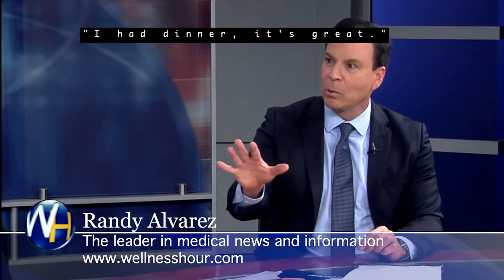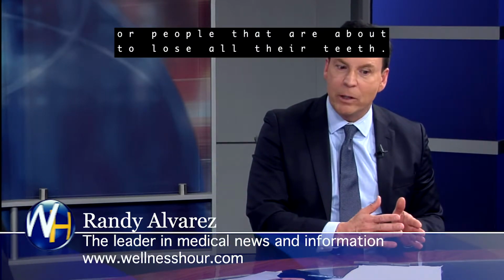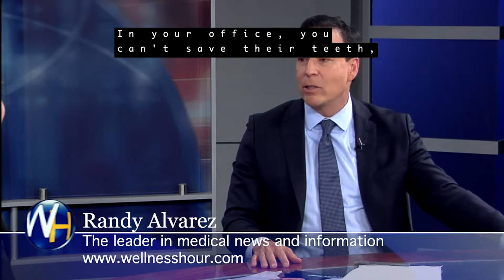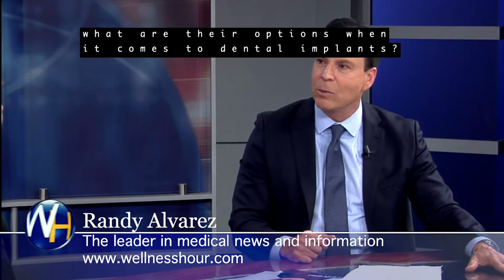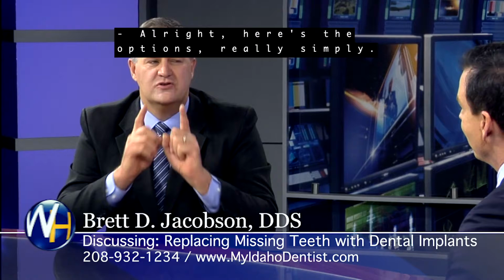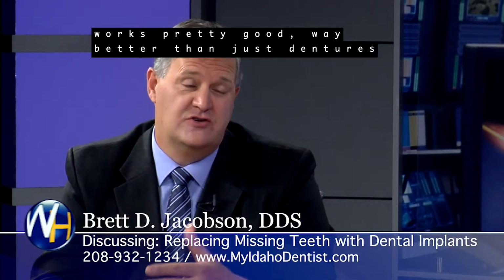It's great. Okay, we're short on time, but let's talk about options for denture wearers or people that are about to lose all their teeth. So two types of patients in your office: you can't save their teeth, all their teeth have to be removed, or the denture wearer. What are their options when it comes to dental implants? All right, here are the options. Really simply, if you have a denture, two implants.